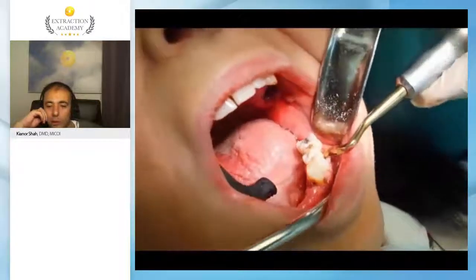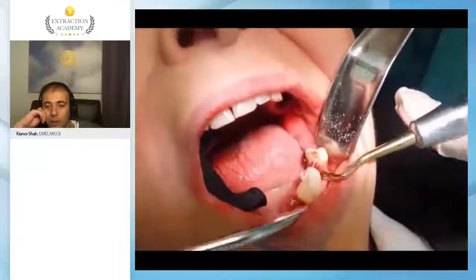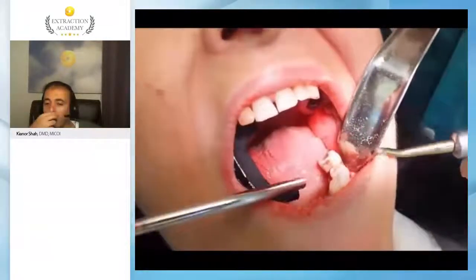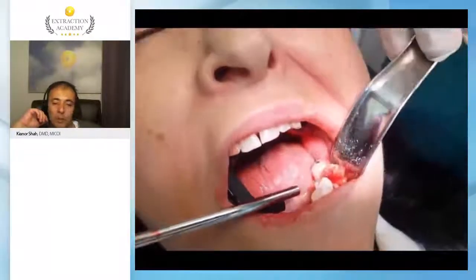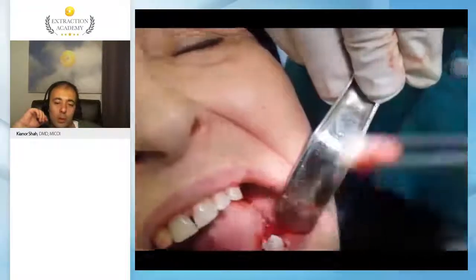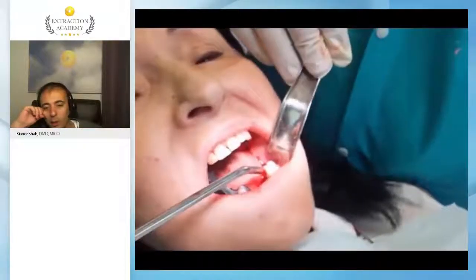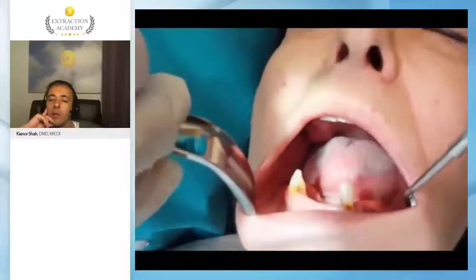Also, straight elevators, curved elevators, will go over their usage and their indications in the course and where they may best suit a situation. The name of the game is naturally how do I weaken the root the most, and my neutral zone being the mesiobuccal on all of the teeth. There's a lot of leeway there to work and start applying that approach.